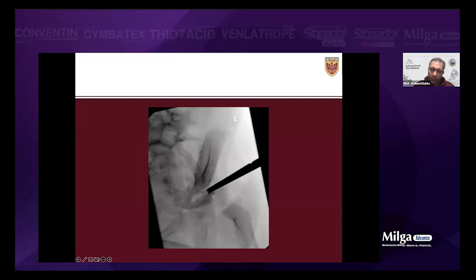I used to go 5 millimeters above and you get a nice, decent acetabular index. But recently I started to go a little bit higher. This gives me a little bit of a shelf at the top of the DEGA, so I get extra coverage in some cases. So go with the straight osteotome first. I go with the straight osteotome until the middle of the ilium, I take it out, and then I go with the curved osteotome, and I stop about 5 millimeters above the triradiate cartilage at this corner. So aim it to this corner, and you stop there.